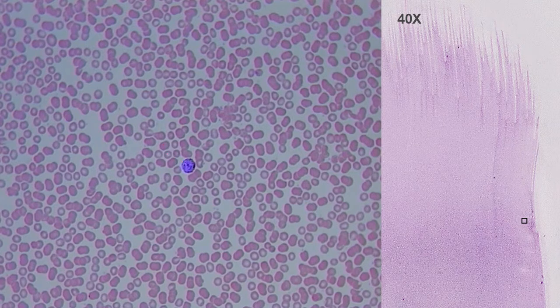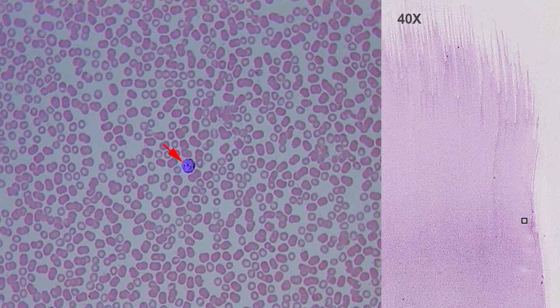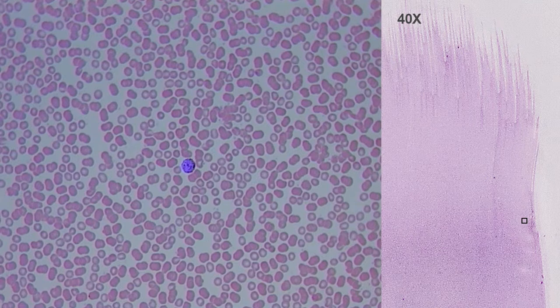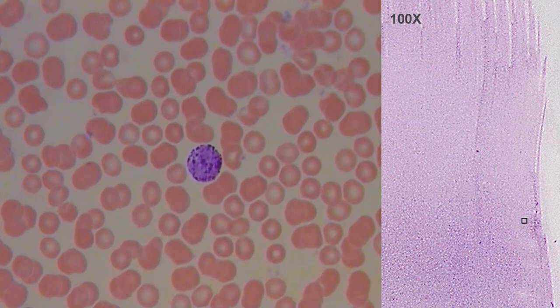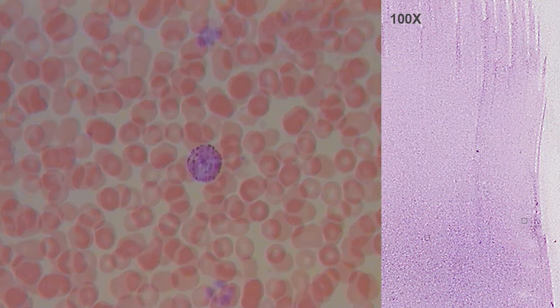Here a polymorphonuclear cell can be seen, characterized by having abundant granules that do not allow us to see the polymorphic nucleus. It is a basophil. If observed with a 100-fold magnification objective, its bluish granules can be seen, since they have been stained with the basic methylene blue dye present in the Giemsa staining.